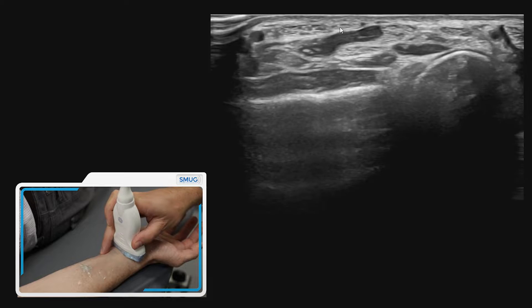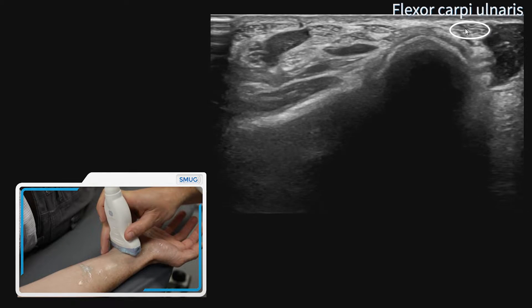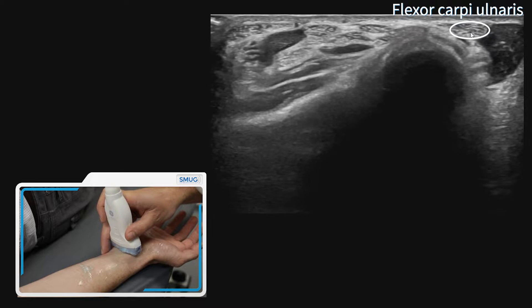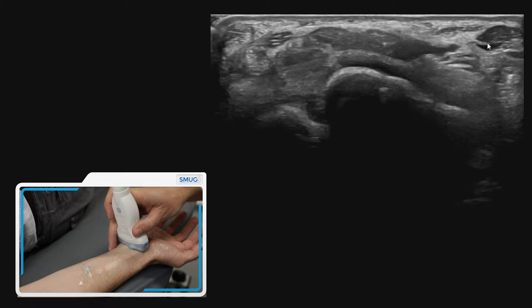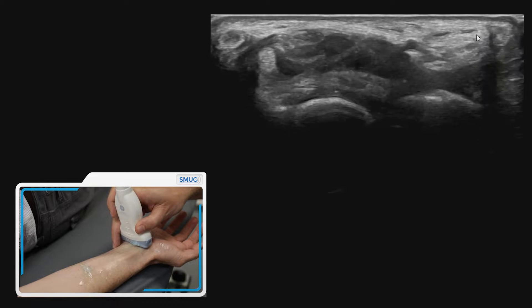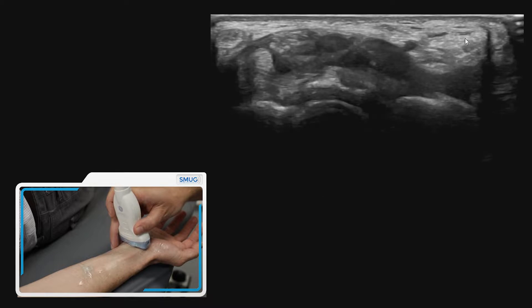If we move towards the ulnar side, you can see the flexor carpi ulnaris tendon, which we can follow down. You can see the muscle belly getting smaller, tapering down onto the attachment of the pisiform, which is just one of its attachments.